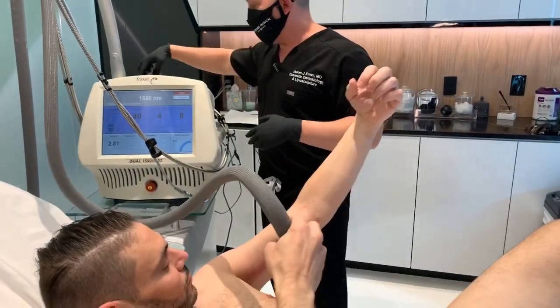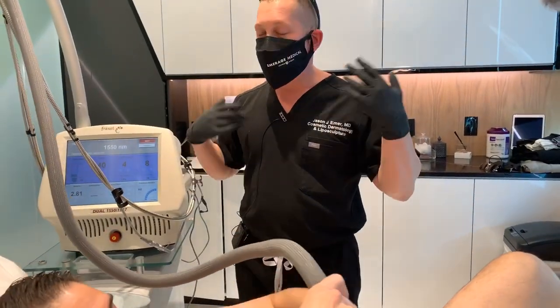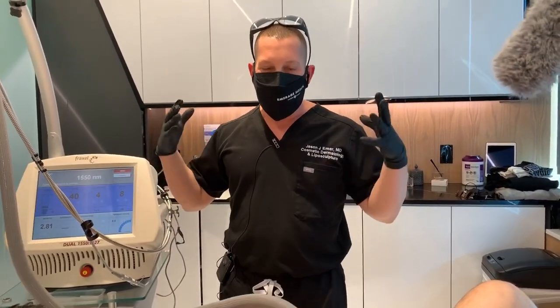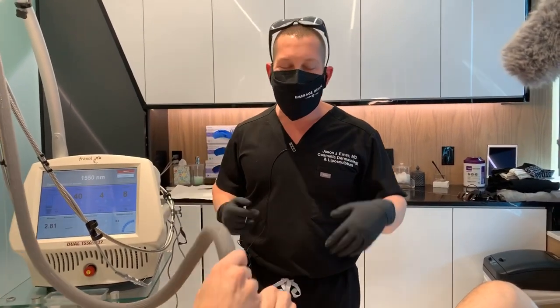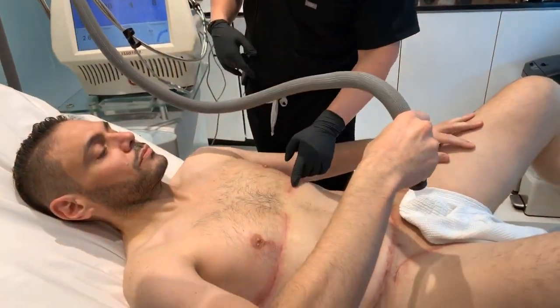and then we do, if he wants, we can even put a little red light on him, decrease the inflammation. And then he just goes to skincare. His big thing now is compression and following healing protocols. And that's it for the next couple months. Then he exercises, then we reassess the body. But the key is lasering early on.